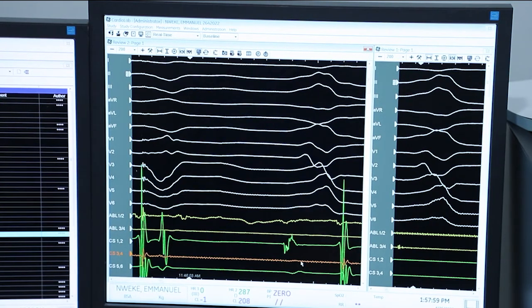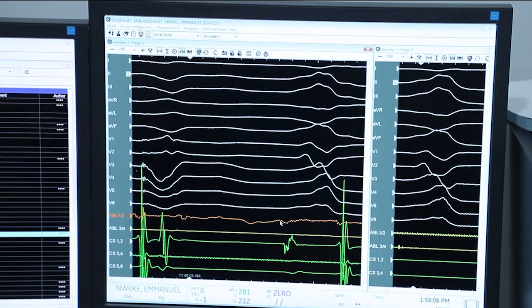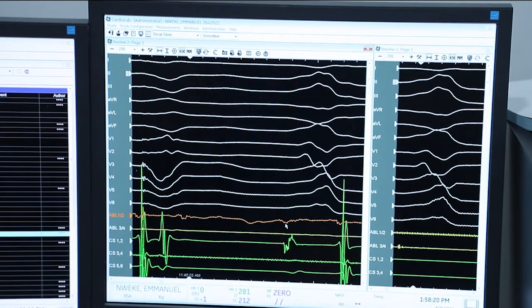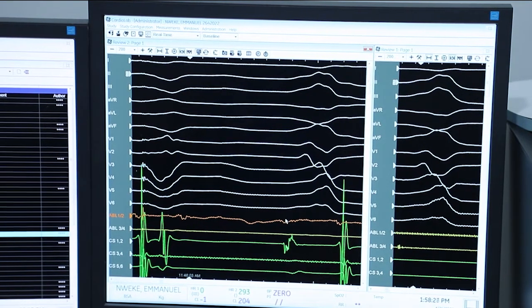This is the left coronary cusp. In the left coronary cusp, we clearly see that a little minute signal is preceding even the coronary sinus and preceding the QRS complex by 36. So this area is highlighted, and we will ablate at such an area after finishing our activation map and voltage map.